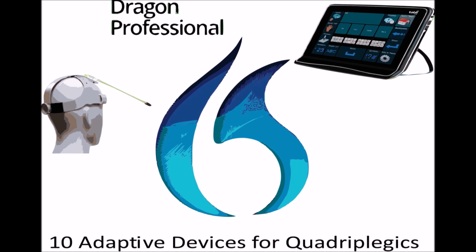Hand splints can also be used to prevent contractures, which are tightening of the muscles or tendons that can lead to a permanent loss of movement or deformities. By holding the hand and fingers in a specific position, hand splints can help stretch the muscles and prevent contractures from forming. Hand splints are often prescribed by doctors, occupational therapists, or physiotherapists as part of a treatment plan.